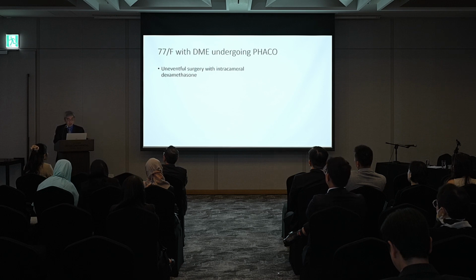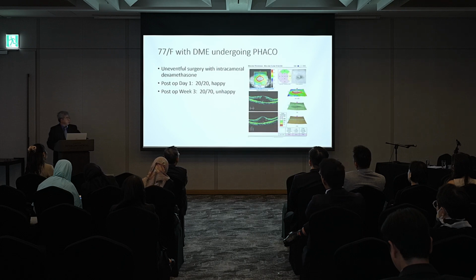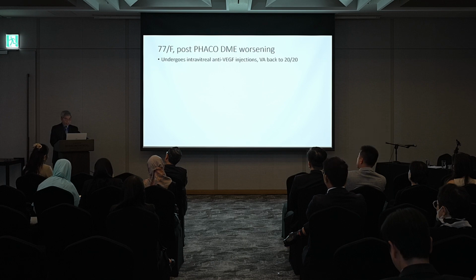But when we showed her her OCT scans and worsening of the edema, she now understands that we were telling her the truth and she should get an injection. And this was her injection pattern. Later on, we wound up just injecting her as needed. So, Adrian, any thoughts about this?